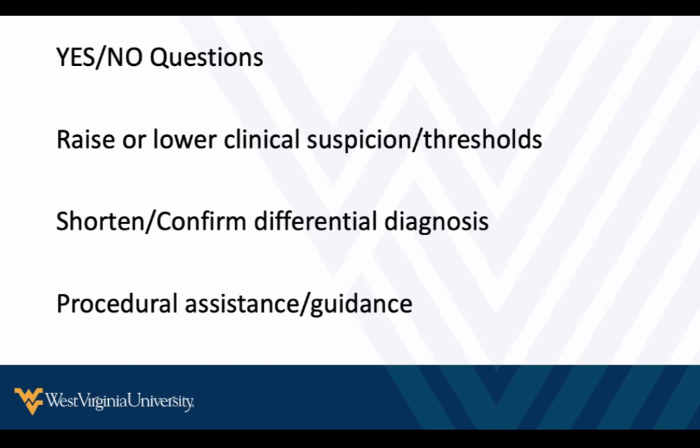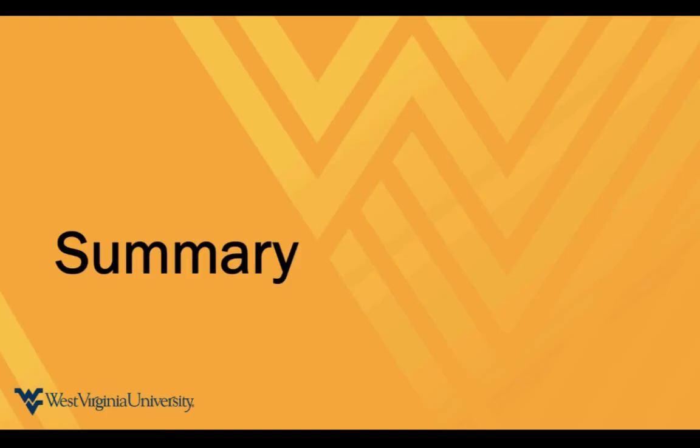Many times we can shorten or even just confirm outright what we're worried about in our differential diagnosis. And we'll talk about that a lot when we look at things like shock and chest pain and things like that. And then kind of separate from all the diagnostic things is using ultrasound as a procedural guide or an aid to our procedures and help us visualize anatomy, and a lot of times help us guide our needle towards a target or a structure of interest. And that's our intro. We'll get into some more details with some of the applications later on.